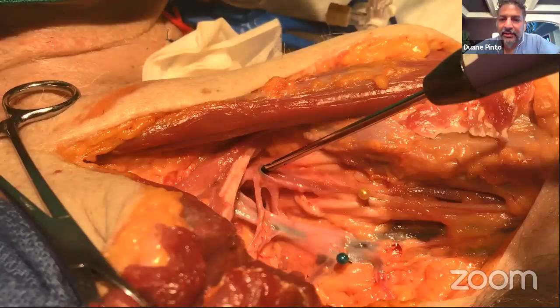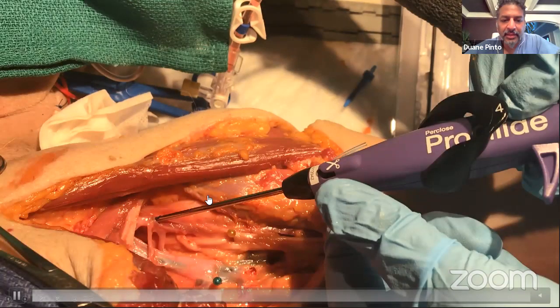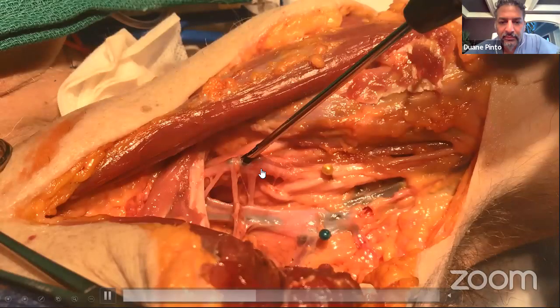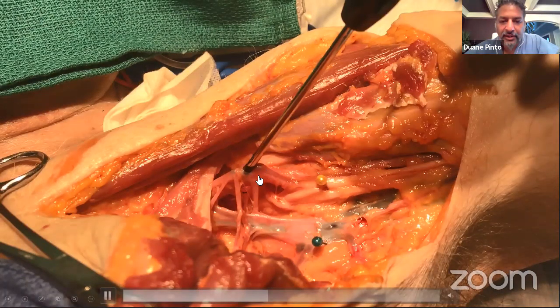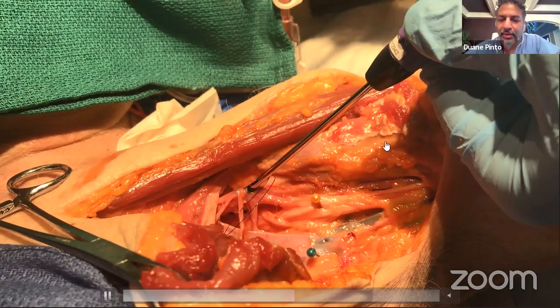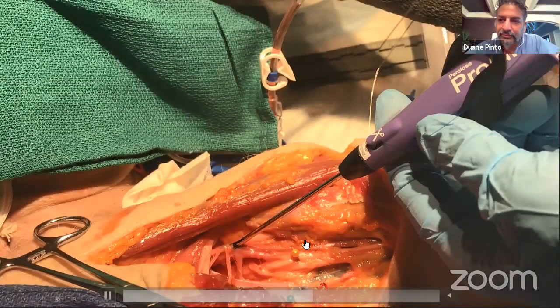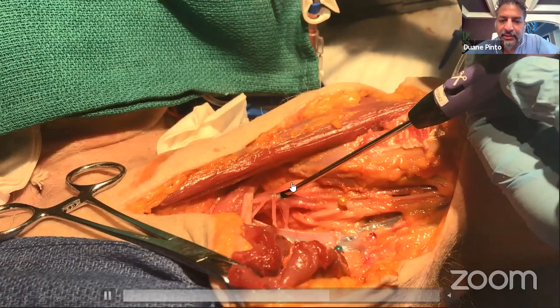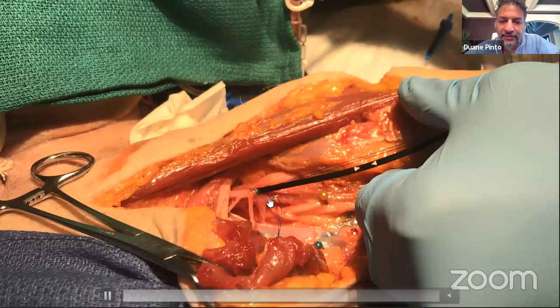And you can see that when you open up number 1, the foot plates are now within the artery. And now when you push down, which has just occurred here, the needles go into the foot plates, and then when you pull number 3, the sutures are pulled through the artery. And you saw those steps there. And when the device is removed, you see now there's a suture, as well as the fisherman's knot there.